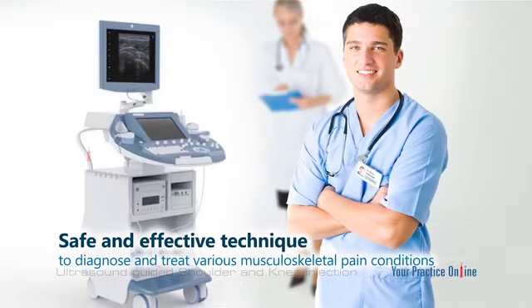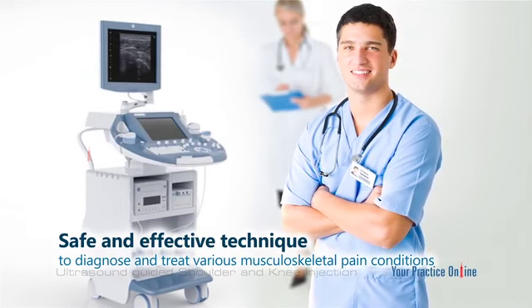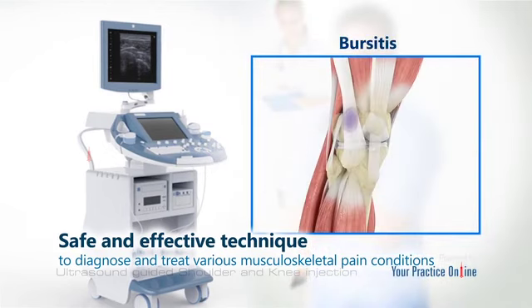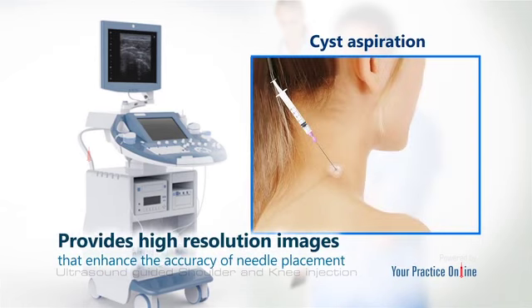Ultrasound-guided injection is a safe and effective technique to diagnose and treat various musculoskeletal pain conditions such as tendinitis, bursitis, and neuritis, and to perform cyst aspiration. It provides high-resolution images that enhance the accuracy of needle placement without damaging the surrounding tissues.